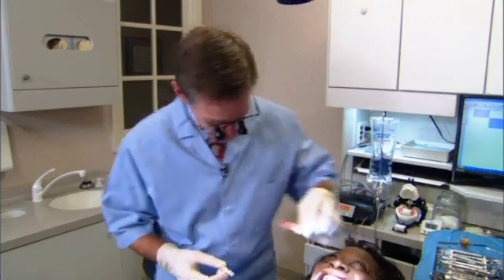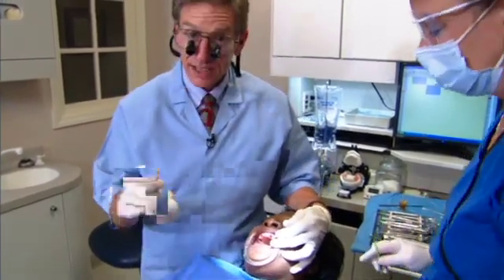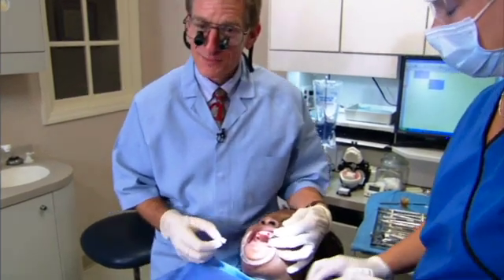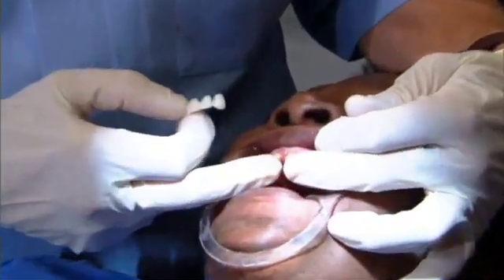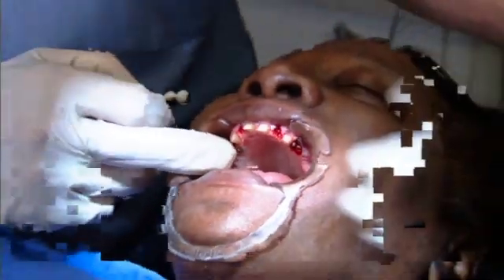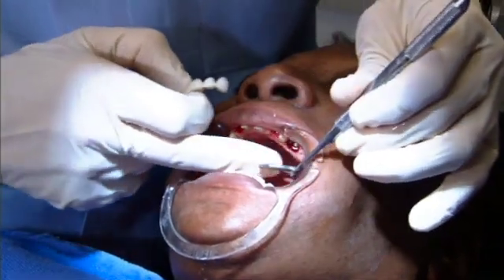Okay? Now, we've put poor Beverly through the throes of hell here today, but I want you to take note. Stephanie, if you'll come down, get down in the mouth with me. You can look at her tissues, her teeth. She really doesn't look abused. She's got a little bit of oozing, but she's already stopped bleeding. The implant sites are nice and clean, no debris.